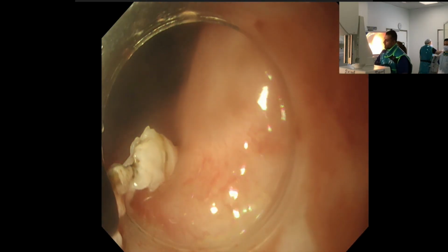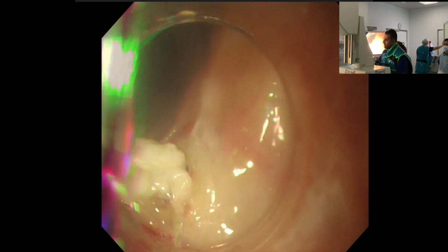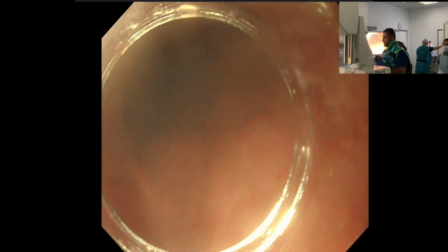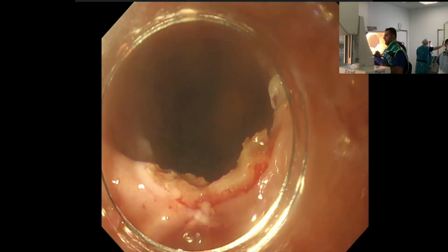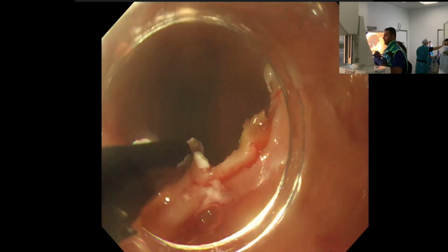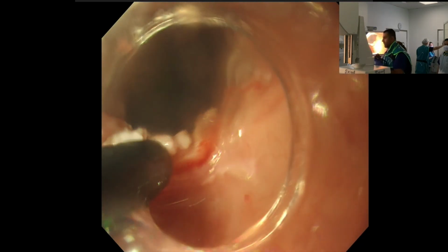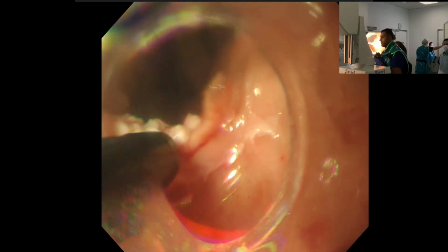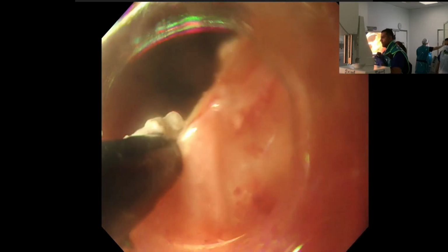It's going to come here from north to south. You can already begin to see just how difficult it can be to get all the way down. So needle out, yes, thanks. Go in the opposite direction here and remove this ridge.